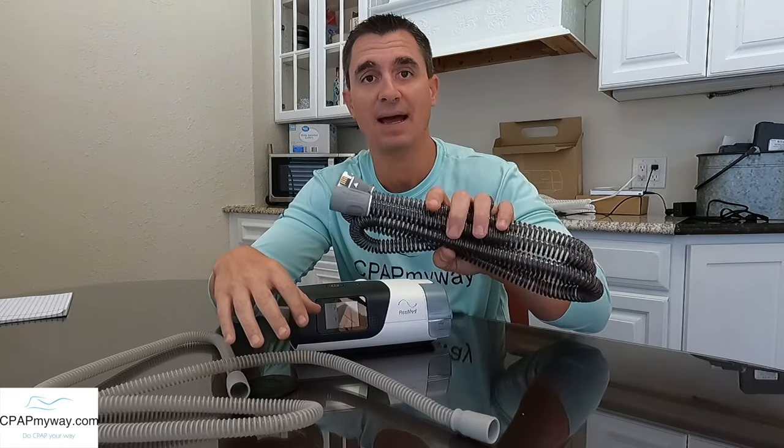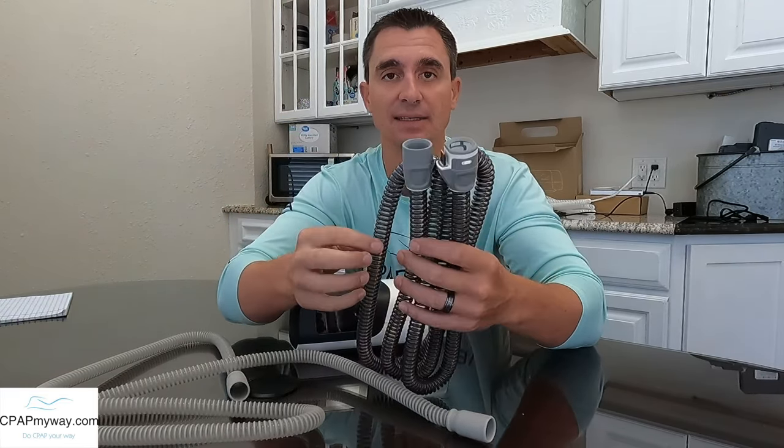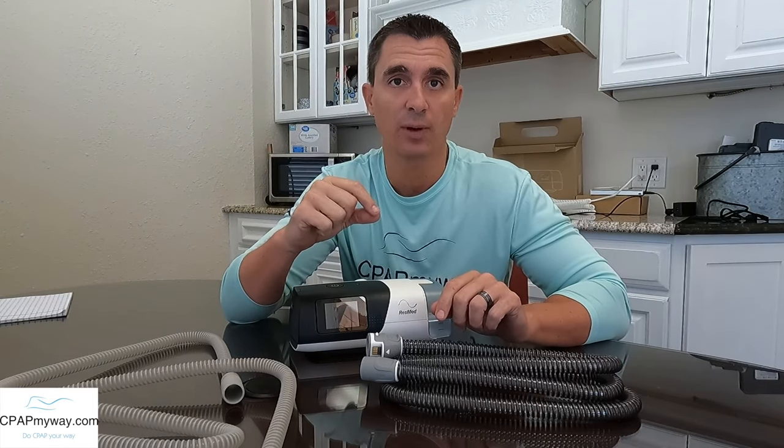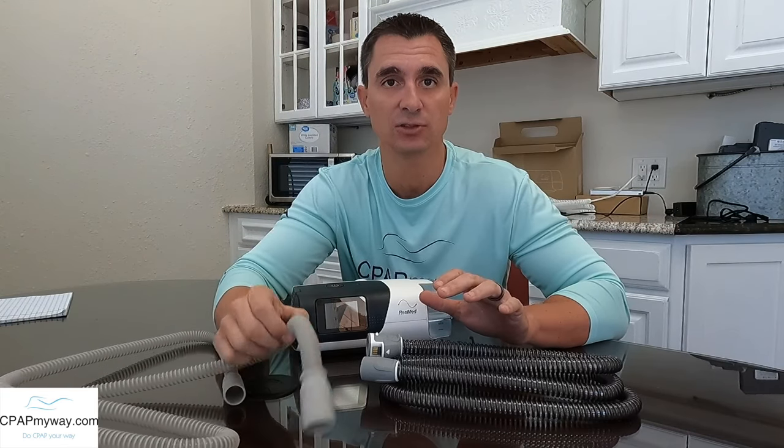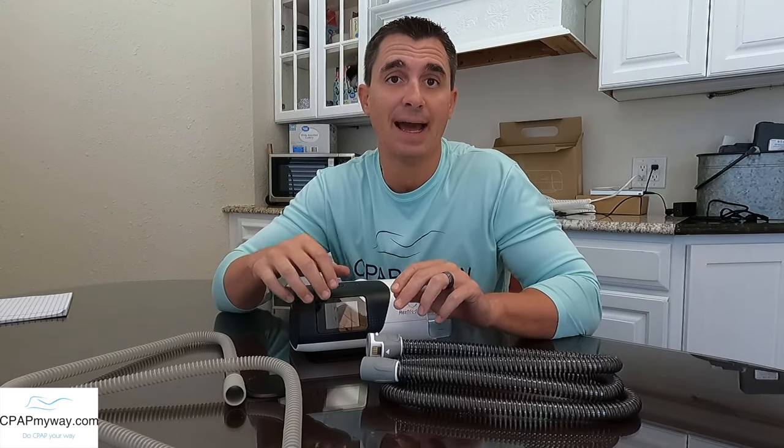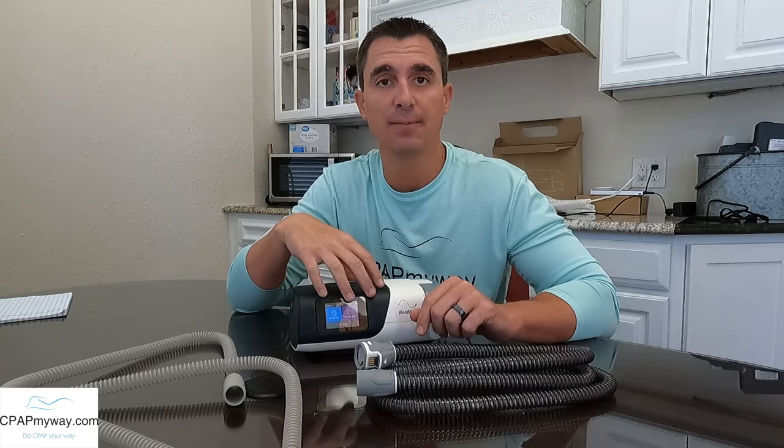The heated tube bypasses that — it keeps a constant temperature from the beginning all the way to the end, which keeps the humidity at a very premium level for you and allows you to add more humidity than you would otherwise be able to if you were encountering your room's ambient conditions with a standard tube. So the top two reasons I would add a heated tube to a CPAP would be if you're experiencing a lot of dryness and you haven't been able to add enough humidity because you're using a standard tube.